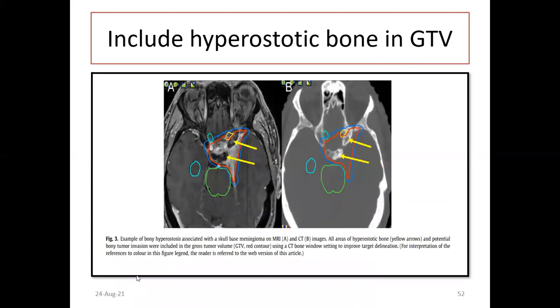Include hyperostatic bone: hyperostasis is associated with skull base meningiomas. All areas of hyperostatic bone, shown with yellow arrows, should be appreciated in the bone window. Potentially involved bone must be included in the GTV, shown in the red contour. CT bone window setting is mandatory for interpretation. Hyperostasis should be included in the GTV and given around 2 cm margin, and must be appreciated in the bone window.